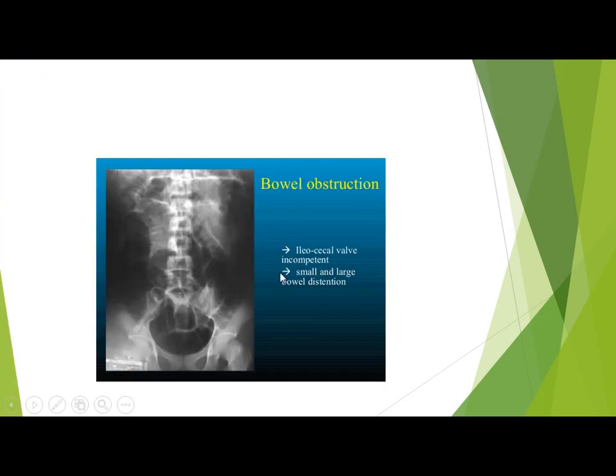This is a case of bowel obstruction when the valve is incompetent. We have a large bowel obstruction, also small bowel obstruction dilated. Both are seen.